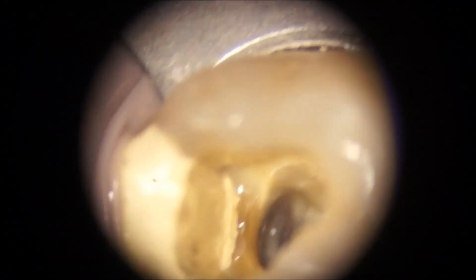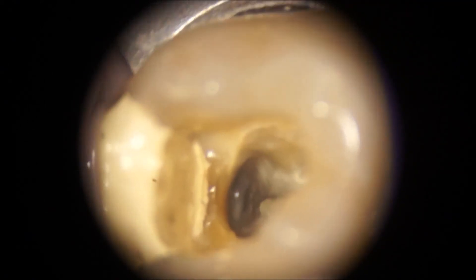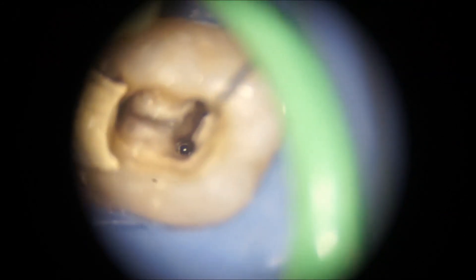What I use to break that debris up is a combination of ultrasonics and sodium hypochlorite to dissolve the organic component out of that collagen obstruction. Ultrasonic activation breaks the fibers up nicely, brings them into suspension, and closer to the orifice of the canal for simple removal by irrigation. For irrigation I prefer 3% sodium hypochlorite during instrumentation, and when there's enough room, 6% sonically activated sodium hypochlorite for at least 10 minutes. I will also use one full minute of EDTA per canal.